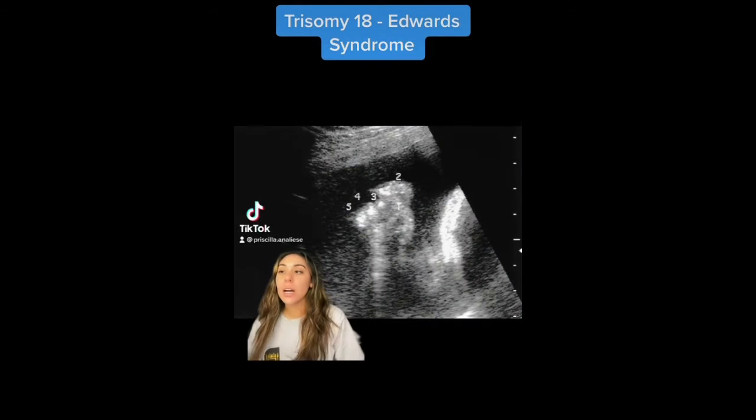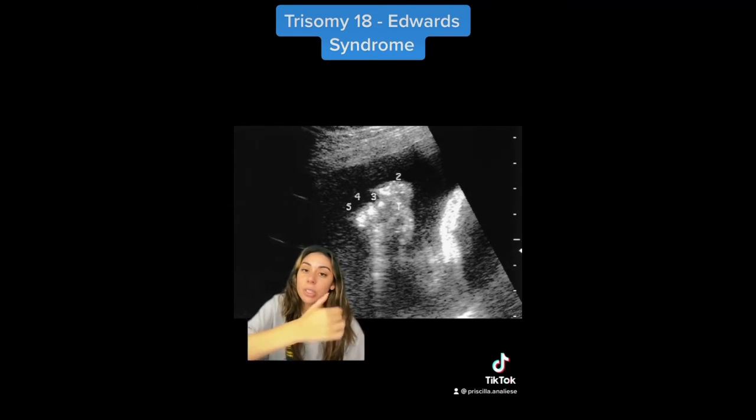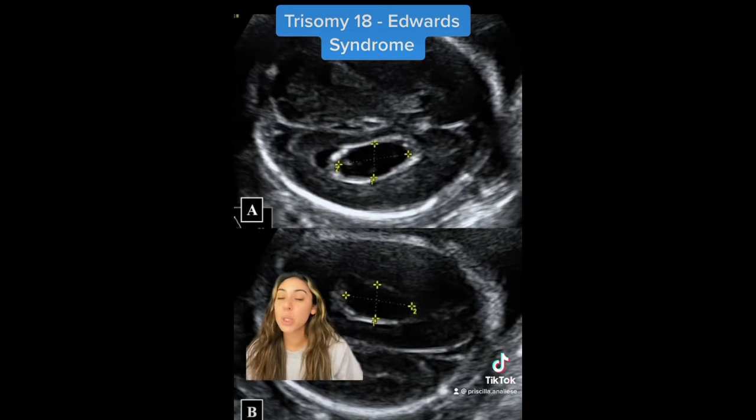So overall, trisomy 18 does have a pretty poor prognosis. 90% of infants do die within the first year, but the sonographic features are evident in 80% of affected fetuses, so it's very important to keep an eye out for these physical features. So some information to remember with trisomy 18 is that 80% of cases display clenched fist, and the mom will have a decrease in AFP.